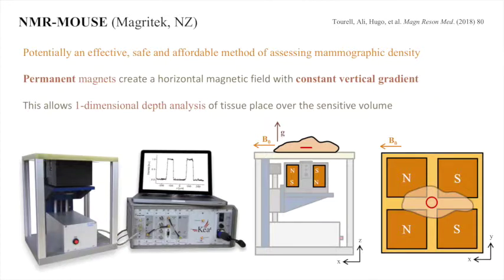The lateral size of the sensing slice is approximately the size of the surface coil that acts as both the transmitter and the detector coil. The assembly of magnets is mounted on a lift that is driven by a high-precision stepper motor, and this allows the sensing slice to be moved up or down, and thus the depth profile of the sample to be obtained.